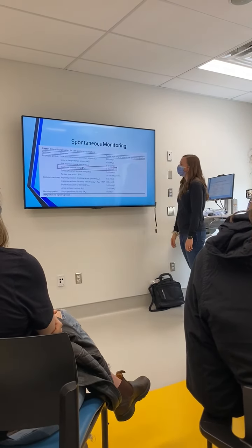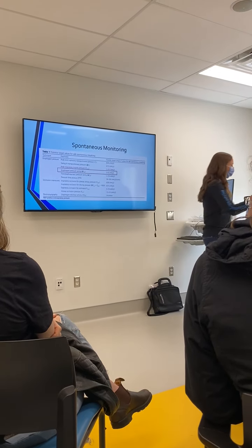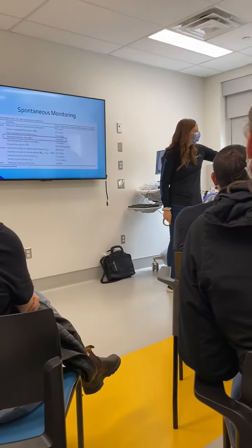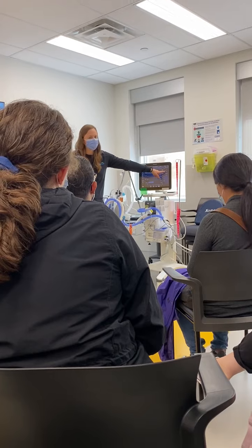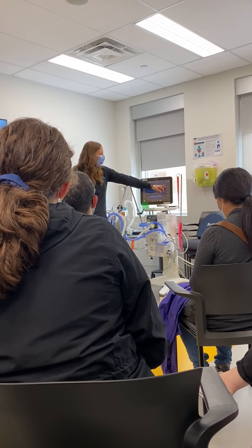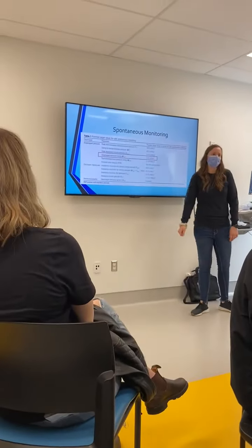So, literature says that you want to keep the swing between 3 and 8 centimeters of water. The vent actually records the number. If you look at it, this delta PS is the swing, so it's recording it always. You can look at it when someone's in pressure support and see what the swings look like. And if it's greater than 8, that means your patient's working too hard.